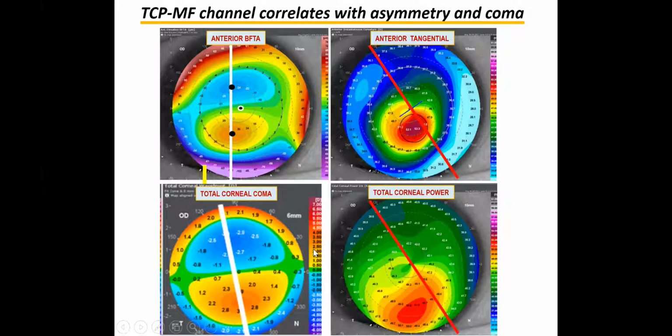So this probably explains how many keratoconus patients can see at different refractions, and can read and can see by far, because they can see by different points in the cornea.